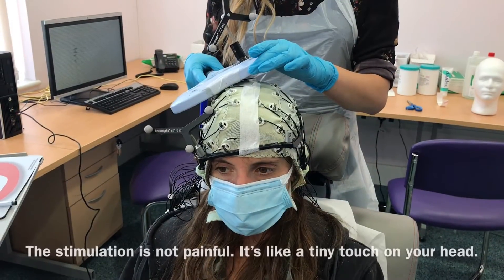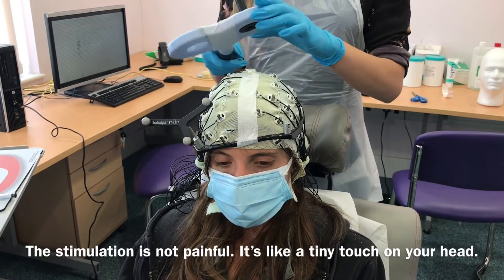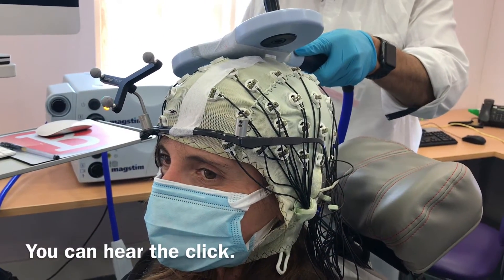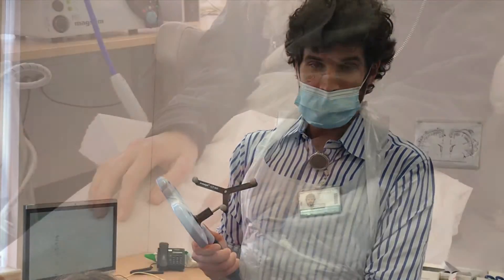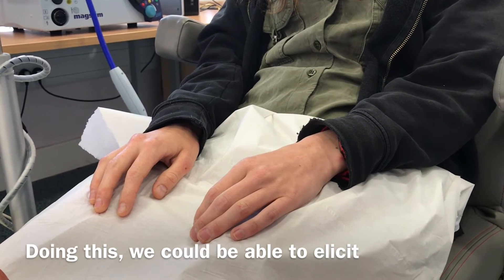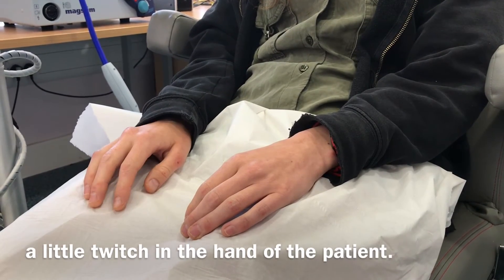The stimulation is not painful. It's like a tiny touch on your head. You can hear a click. Stimulation means that we are gently activating a small area of the brain, and doing this we could be able to elicit a little twitch in the hand of the patient.